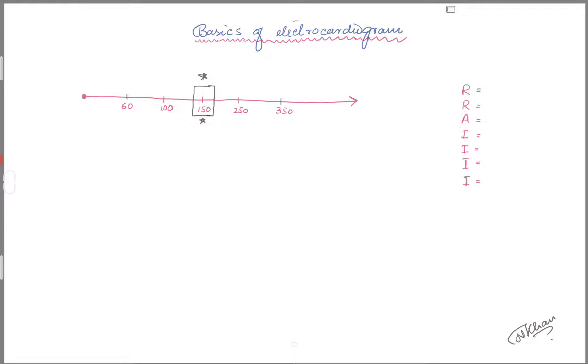The way I look at EKGs is with a mnemonic called RRA and 4i. It's Rate, Rhythm, Axis, Ischemia, Injury, Infarction, and Intervals. I guarantee you that if you have a mnemonic like this and touch these things, about 80% of the time you will get all the things in the EKG which you need to know.